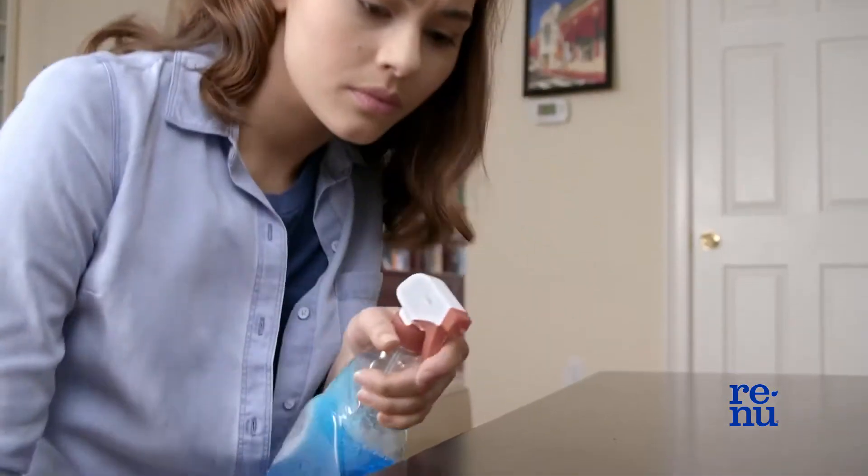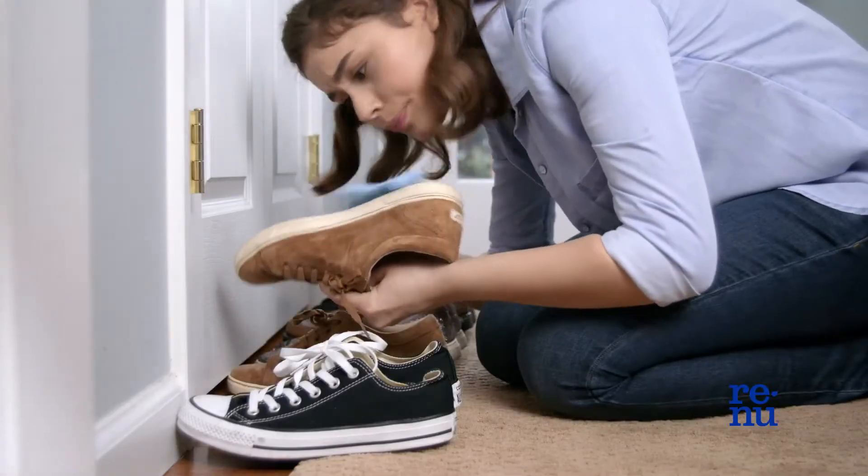That's better. Your screen was a little dirty and I'm a bit of a clean freak about, well, everything. Especially about my contacts. That's why I use ReNu solution.